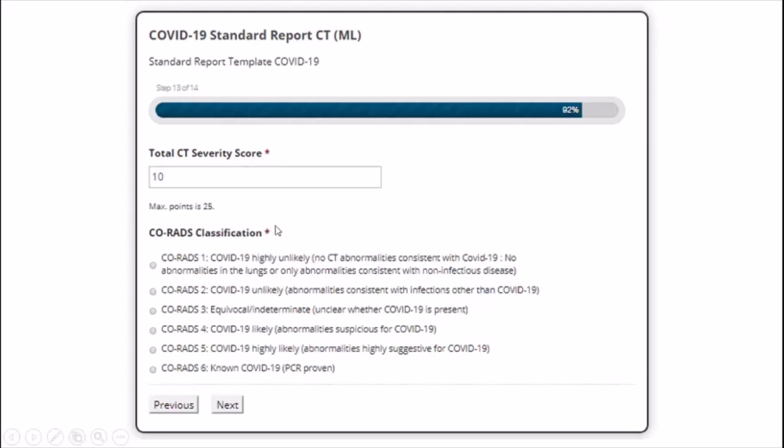And now this part is something that I really like. Nowadays there's a shift towards standard reporting in radiology. Maybe the most commonly known is BI-RADS. For the thyroid, we have TI-RADS. Now we have LI-RADS for the liver. For the prostate, I think PI-RADS. So everyone is trying to create a standardized system, which is really good and a very efficient way to communicate with clinicians and also between radiologists in follow-up images.